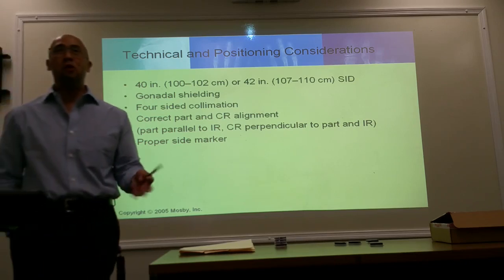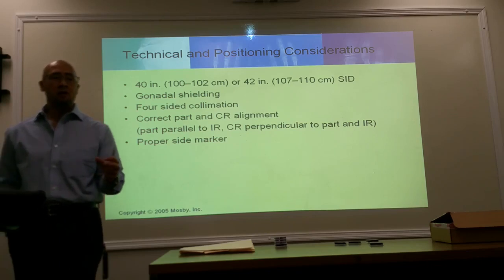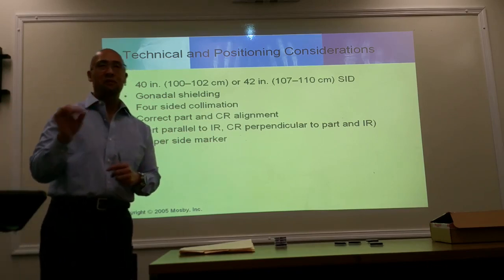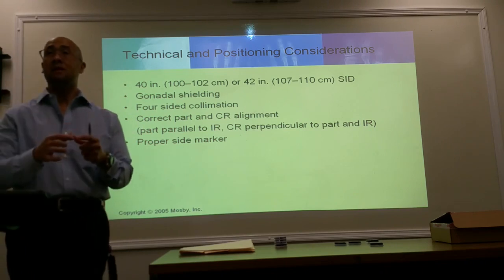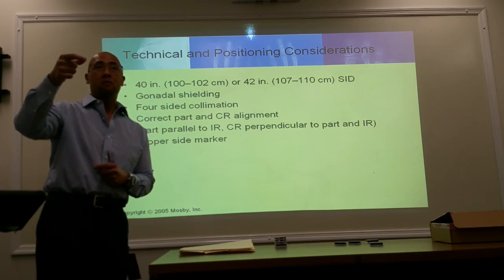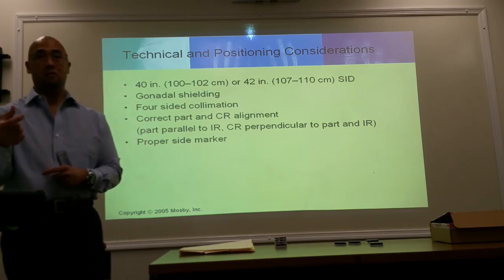Do you guys know what Mitchell markers are? No. Okay, these markers have an area with, I won't say free-floating BBs, but there are BBs embedded in the marker. And they kind of move around based on the position of your marker.